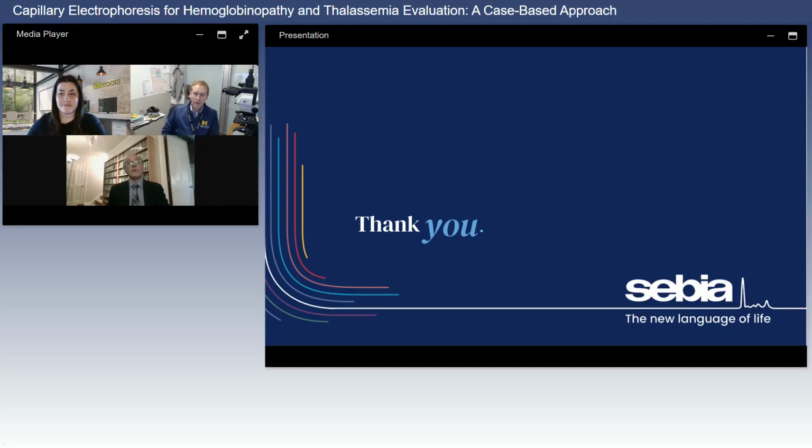Yeah, thanks for that question. So it's a pretty complex topic. So to keep it simple, hemoglobin F elevations in pregnancy are routinely low, below 5%, and they are also routinely benign.